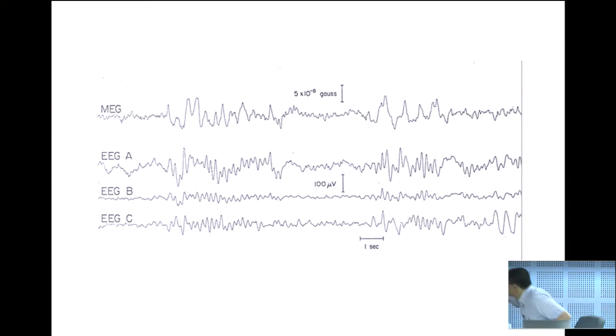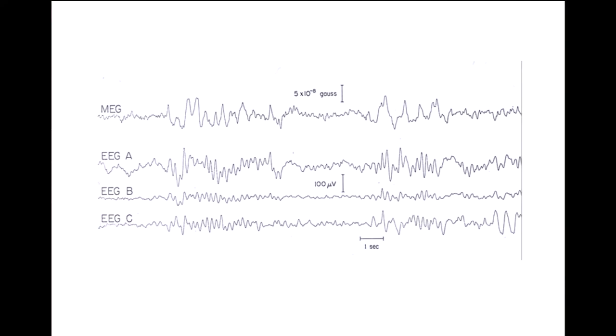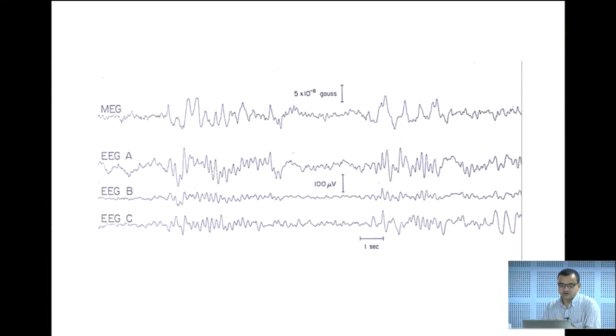Here he also recorded, if I recall correctly, in 1972, almost before I was born. It looks like these are some kind of epileptic spikes, so the patient had some epilepsy. It doesn't look to me like a healthy brain. But that's not the point he wanted to make.